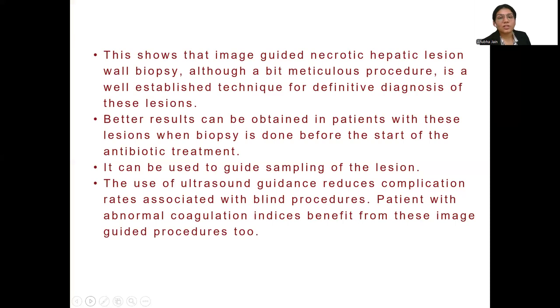This shows that in image-guided necrotic hepatic lesions, wall biopsy, although a bit meticulous procedure, is a well-established technique for definitive diagnosis of these lesions. Better results can be obtained in patients with these lesions when biopsy is done before the start of the antibiotic treatment. It can be used to guide sampling of these lesions. The use of ultrasound guidance reduces complication rates compared with blind procedures. Patients with abnormal coagulation indices benefit from these image-guided procedures too.